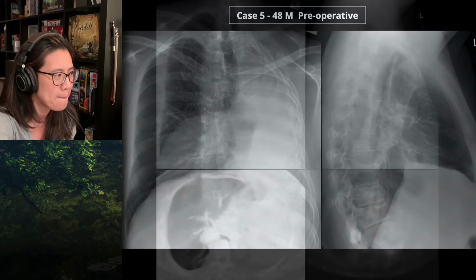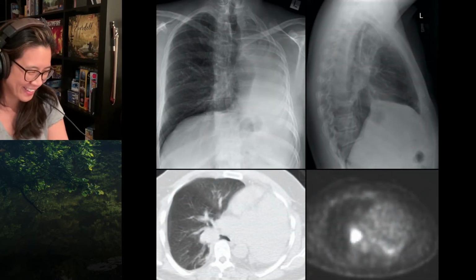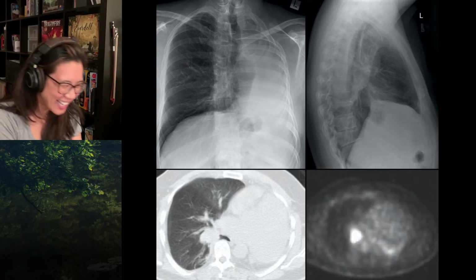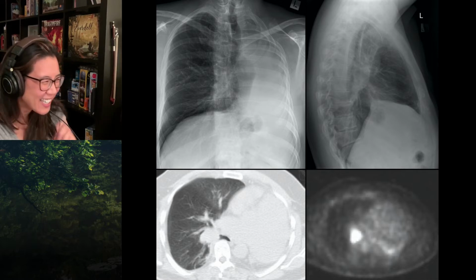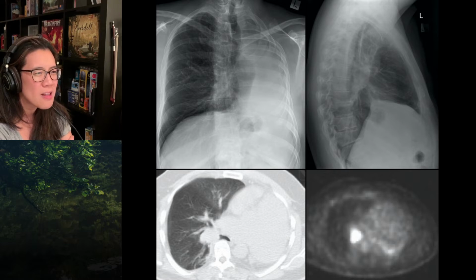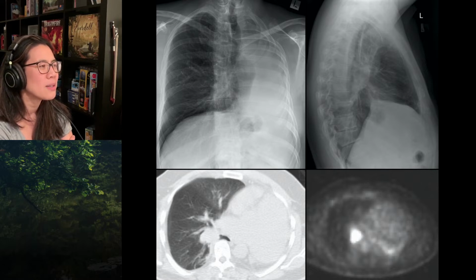Okay. But if you go to the next slide, you'll find you've now missed a 5 centimetre lung cancer in the solitary lung. Oh, God. Wow. That's sobering. Right. So, yeah, that density is real. Excellent. Where is it on the lateral, Bob? I can't be certain. It's got to be just in front of the vertebral body, but I seriously can't see it clearly on the lateral. Okay. All right. Wow.